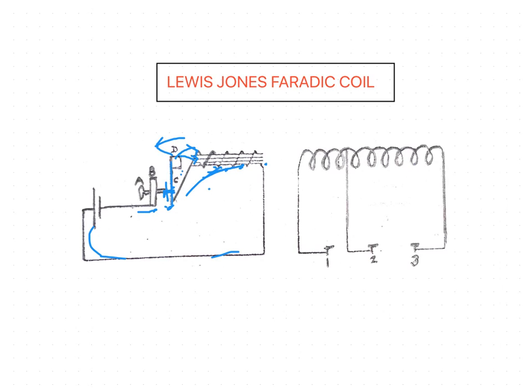When the primary current falls, the self-induced EMF tends to prolong the flow of current. It cannot do so to any great extent as the circuit is broken, but sparks pass between the screw and the hammer, prolonging the flow slightly.